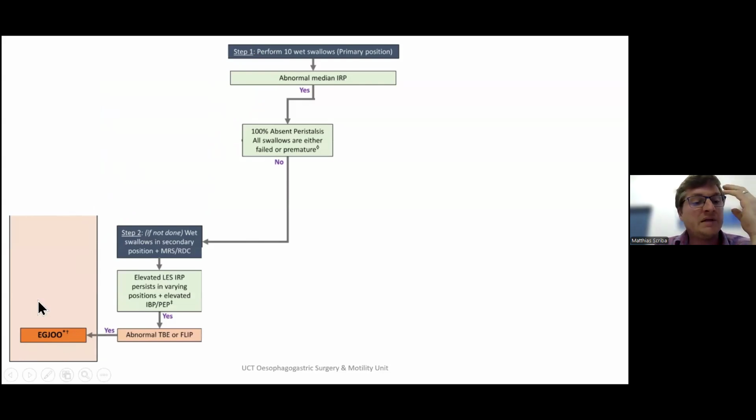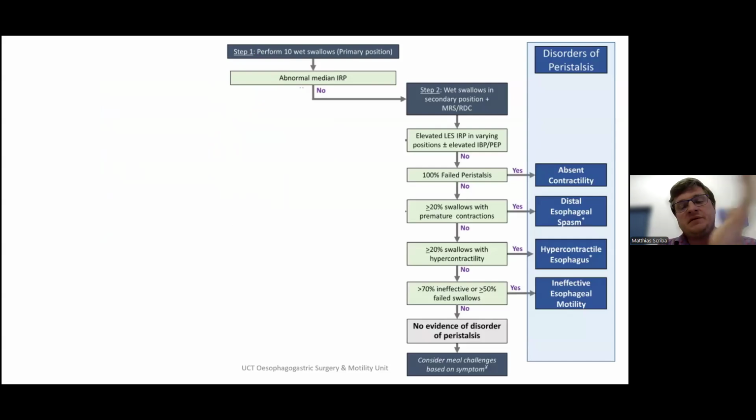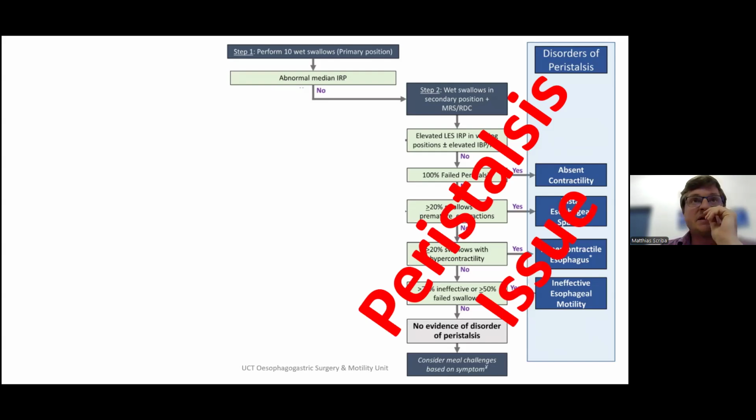Now, this has a huge variety of different causes in it. Some of these patients may well be what we call achalasia in evolution, but we get a whole range of other problems that give an outflow obstruction: strictures, pseudoachalasia, etc., etc. On the other flip side of the coin are the cases where the IRP is normal. So in other words, it's relaxing. It's not achalasia. It's not an outflow obstruction. But then we look at whether there's a peristaltic issue.